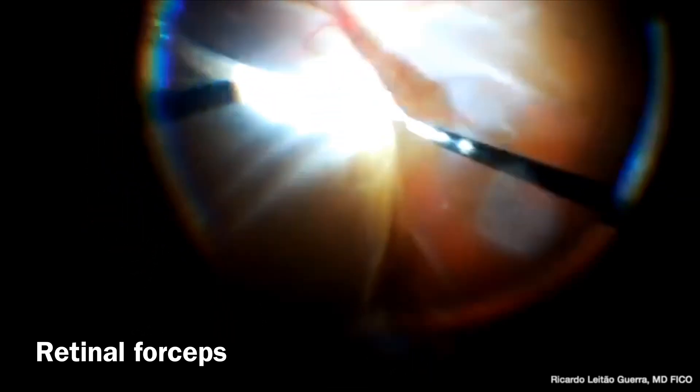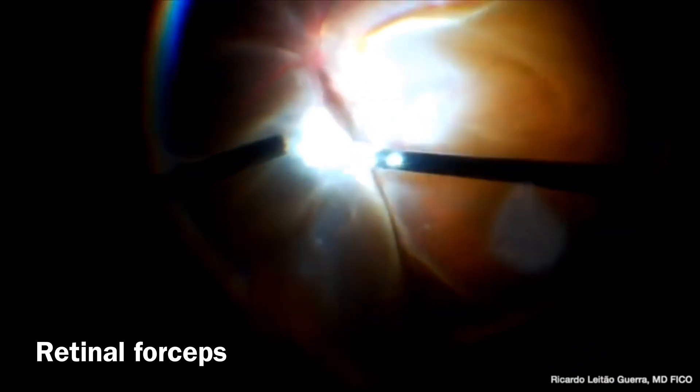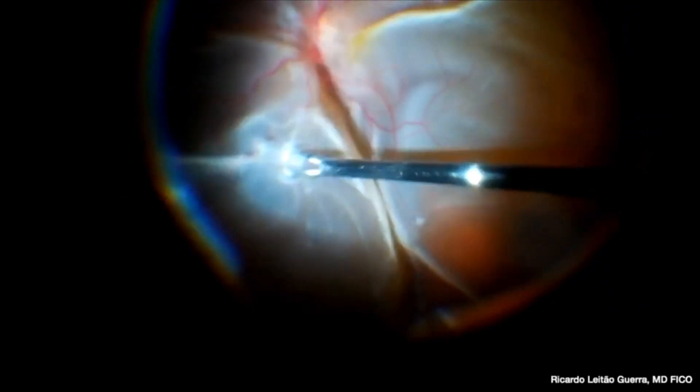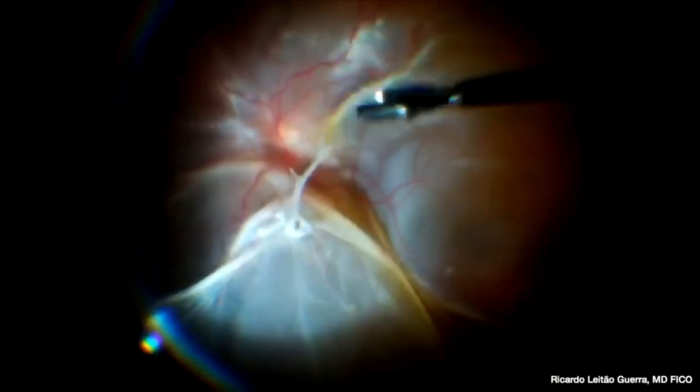For this step, you can try to remove the subretinal band completely in one piece, or it may be simply divided and allowed to retract under the retina.